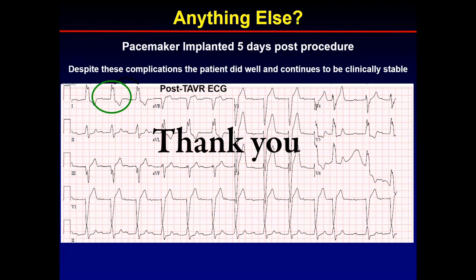But we actually presented in the low-risk TAVR that we did about 15% in the balloon expandable and 0 in the self-expanding. But this is a small cohort, mainly for the balloon expandable. If I have to make a prediction, you are going to see it in the balloon expandable more than the self-expanding. What to do with that?